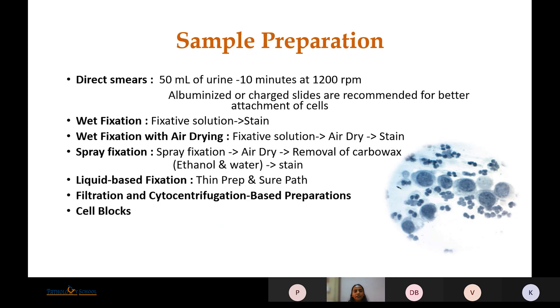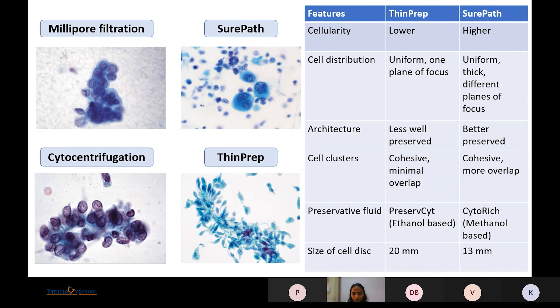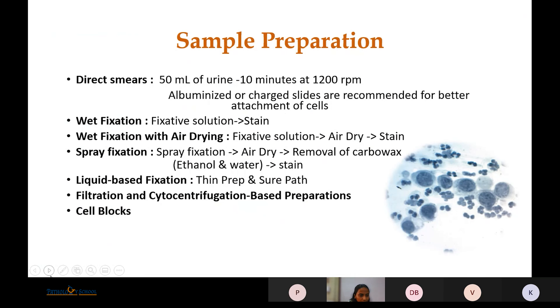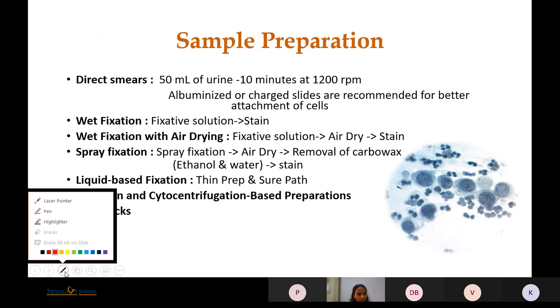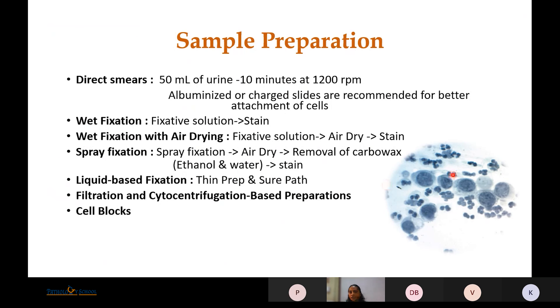In spray fixation, a commercially available spray fixative is used. The slide is air dried, but before staining it is imperative that the carbo-wax, a content of the spray fixative, is removed. Otherwise, as we can see in this image, the nuclear chromatin details are not very clearly visualized and the slide appears to have a thin waxy coating over it.